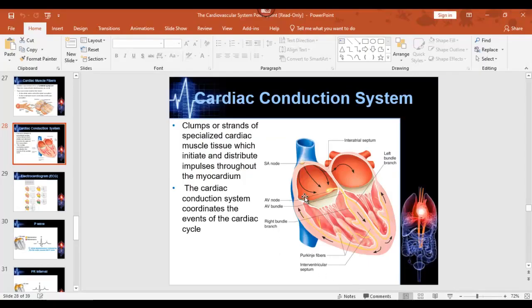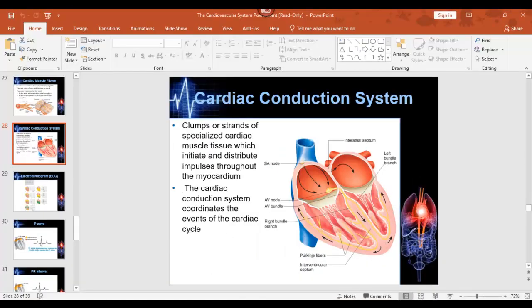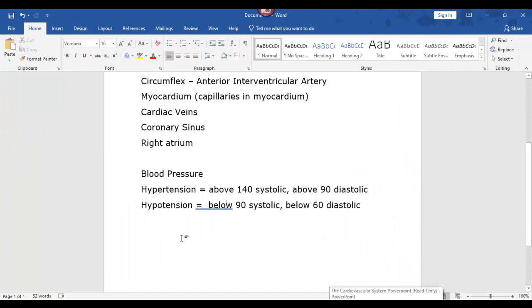We already covered that. So these being electrical currents, action potentials, that machine is specialized to pick up those electrical signals. And also, you can filter out other stimuli, other muscle contractions. This is why you can run on a treadmill and have an EKG on you. But an ECG is actually monitoring this little conduction system and any issues that might arise from that. So if you've never seen a machine before, I have a little introduction for you.